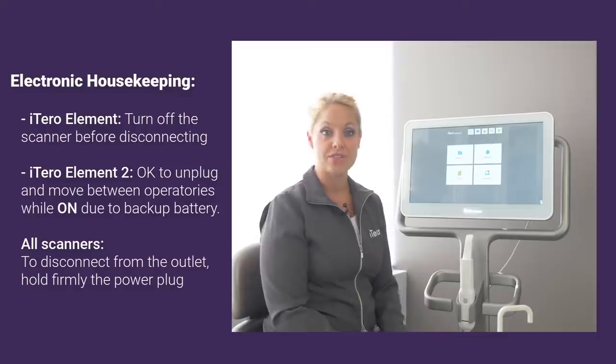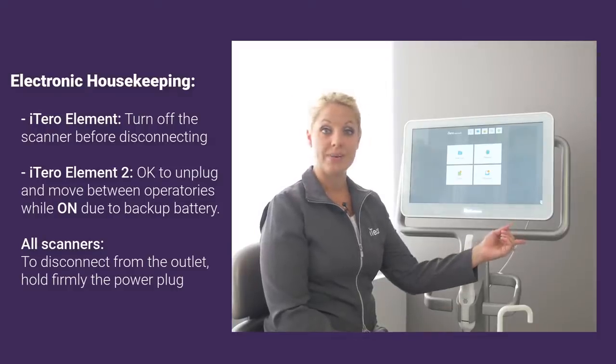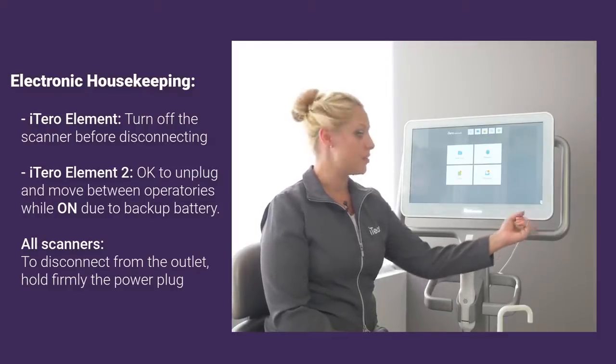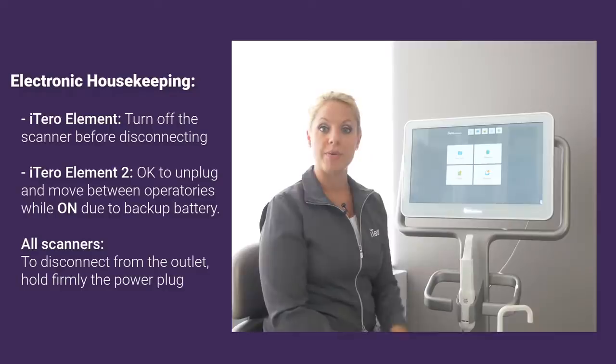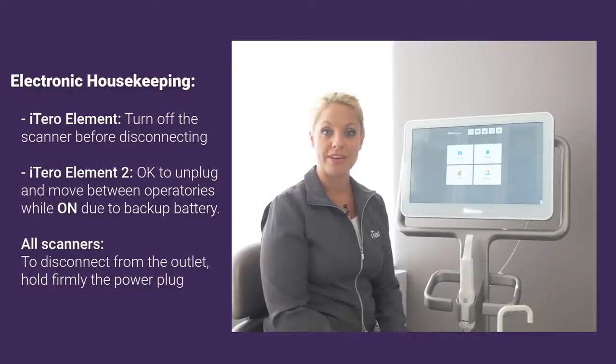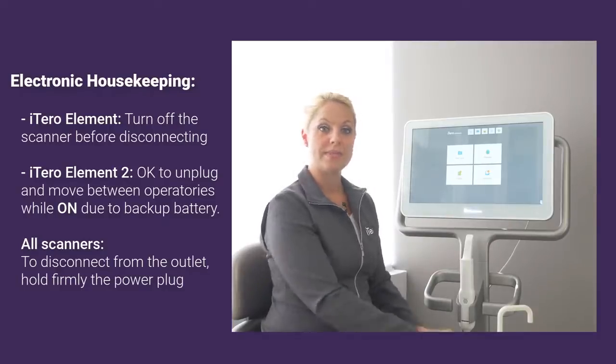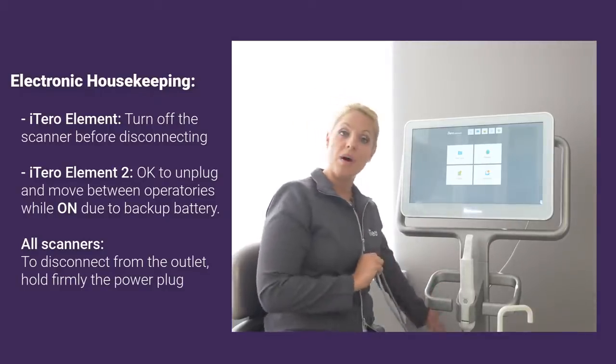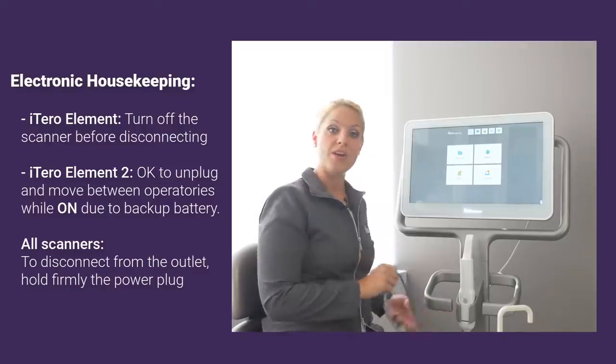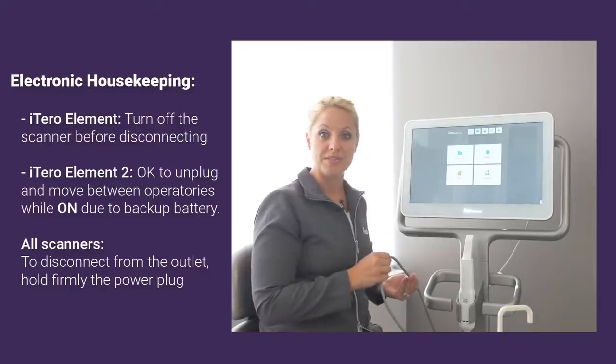So you do have to make sure before you unplug an iTero Element 1 to quickly press and release the power button on the monitor, and then make sure that you take the plug from the wall and pull it rather than pulling from the center of the cord.